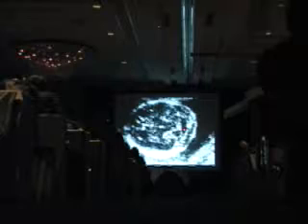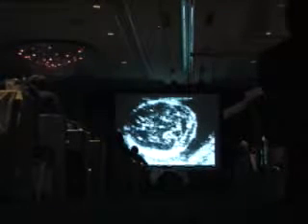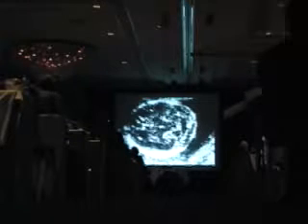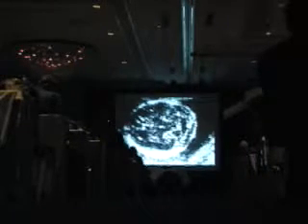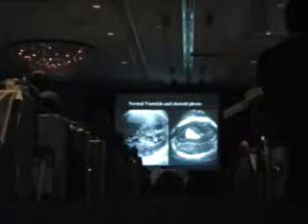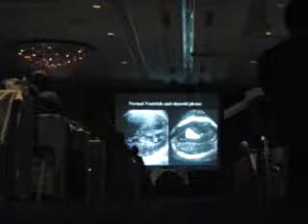Behind it is a fluid collection, which is normal, and which is the cisterna magna. You want to make sure that's there because in an Arnold-Chiari type 2 malformation where the whole thing is sort of pulled down the foramen magnum, this space is obliterated, and that is one of the excellent signs of an open neural tube defect.